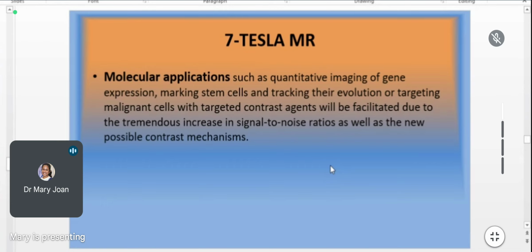And in order to help that identification, we can use contrast agents, some targeted agents, some chemicals, not like we inject into the vessel and it will go wherever blood supply is there. Some of them will get absorbed only in certain tissues. So only if there is one particular type of modification or a difference or disease condition, that will be seen. Otherwise it will get out in the blood supply itself. It will not go anywhere else. So all these things are possible. So we are manipulating the features and adding additional features to get the desired results.